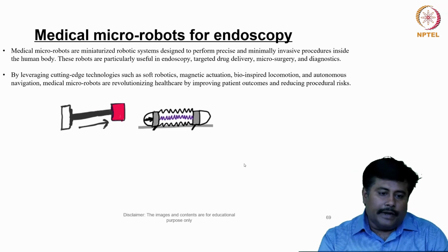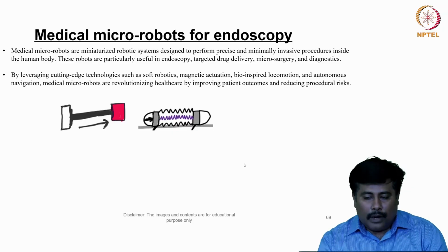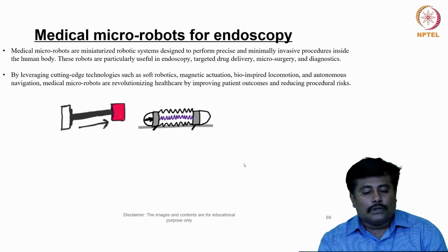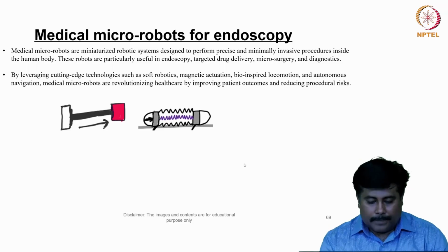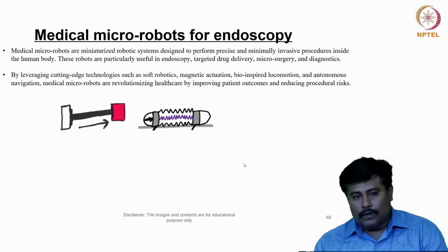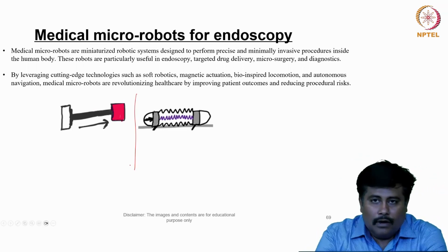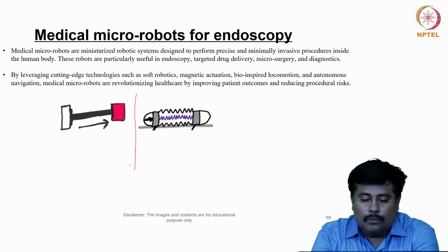So by leveraging cutting-edge technologies such as soft robotics, magnetic actuation, bio-inspired locomotion and autonomous navigation, medical microrobots are revolutionizing healthcare by improving patient outcomes and reducing procedural risk. Now, if we closely observe the mechanisms for developing these microrobots from an endoscopic point of view, two mechanisms are well established for locomoting these microrobots for endoscopic systems.